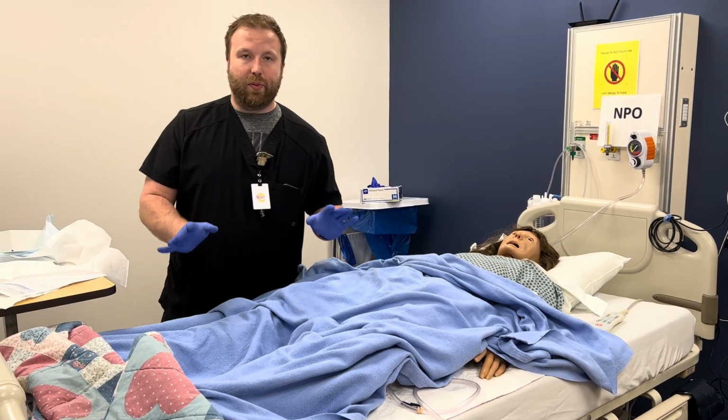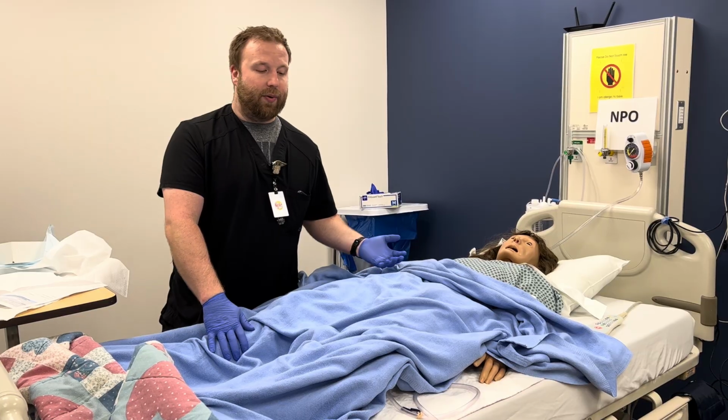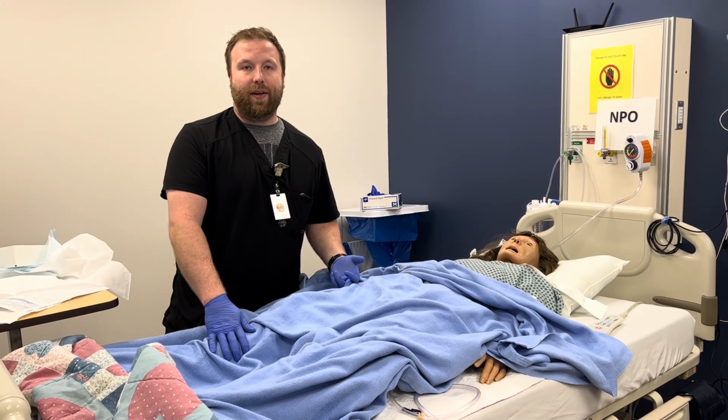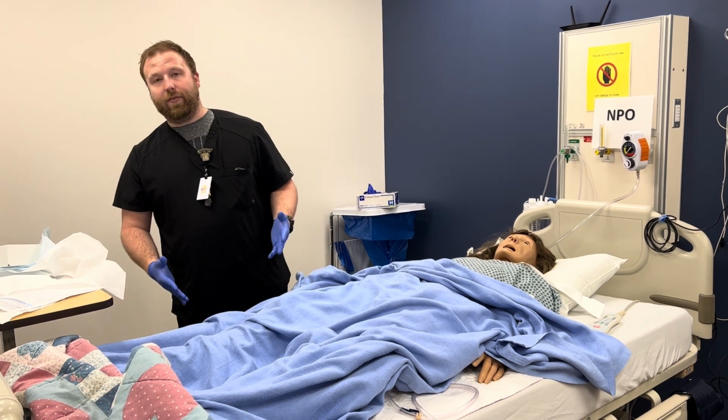I'm going to take off my gloves, wash my hands. And I want to document that I used sterile technique, and I want to describe how much urine that we got in the bag and the characteristics of the urine. And that would be it for that validation.